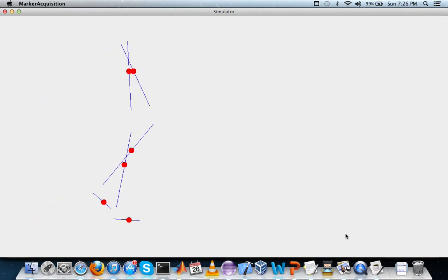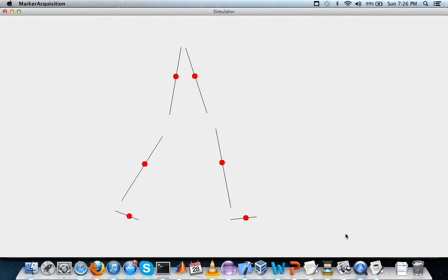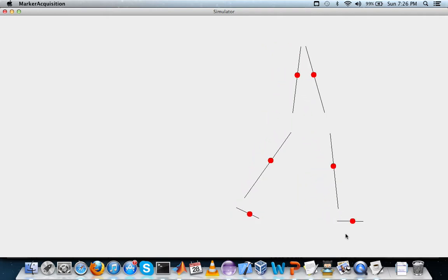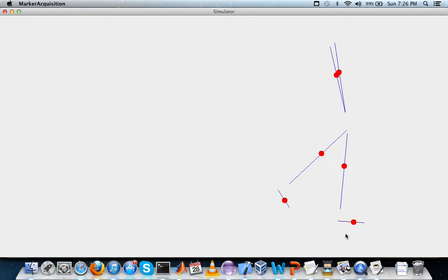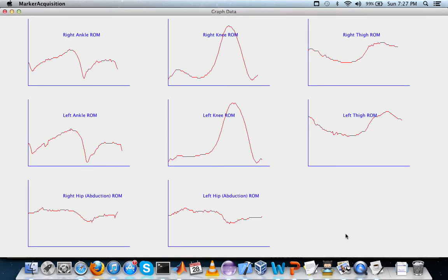the data is for. Now, since it's a normal human being, you can see the walking pattern is pretty similar to a normal walking pattern, or at least it should be. When there are two legs on the ground, the program identifies it and goes black, and when it's a left swing, it goes blue, and on a right swing, it goes green. The next thing that the program generates is a table of graphs.